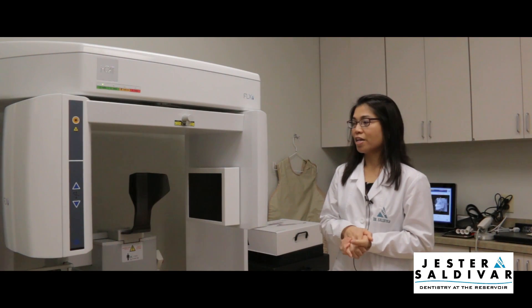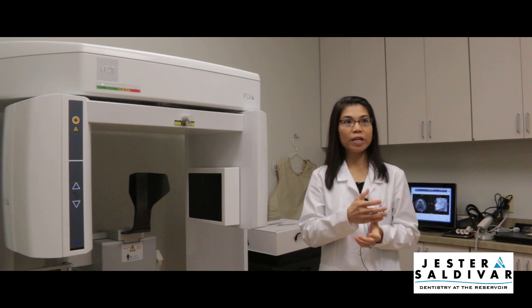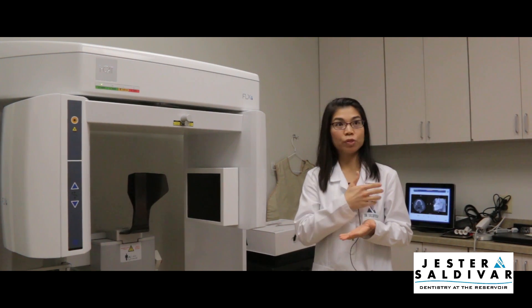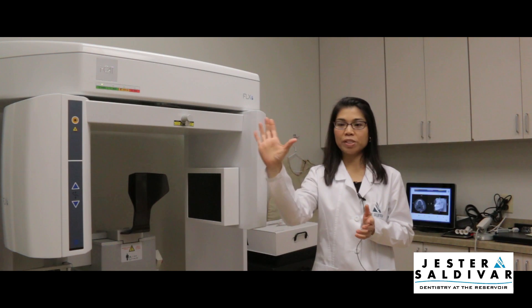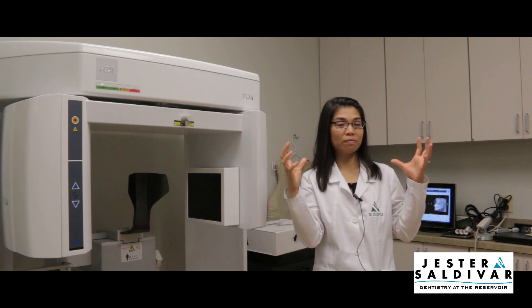This is iCatFlex and it is a 3D cone beam x-ray. What it does is it replaces the Panorax machine, which was the standard x-ray unit that would take an x-ray all the way around your mouth to show you all your teeth.